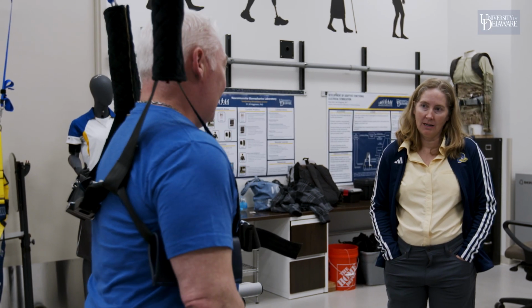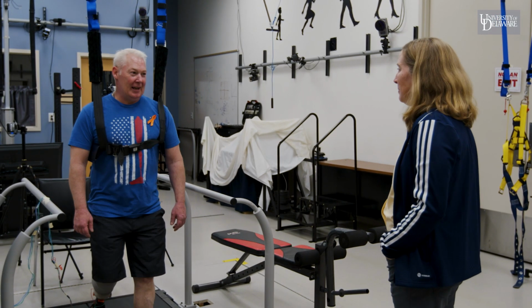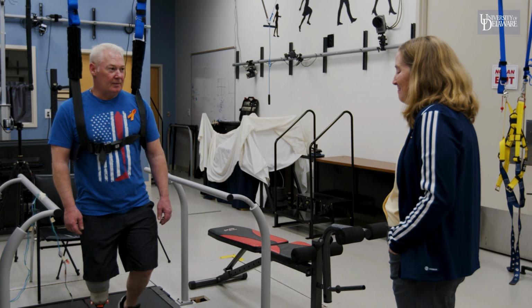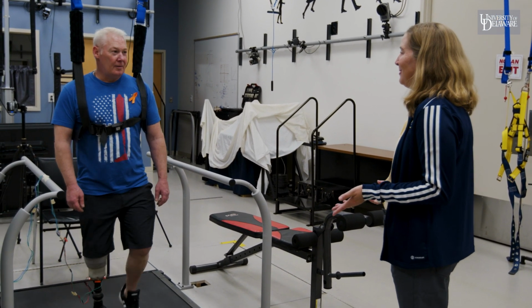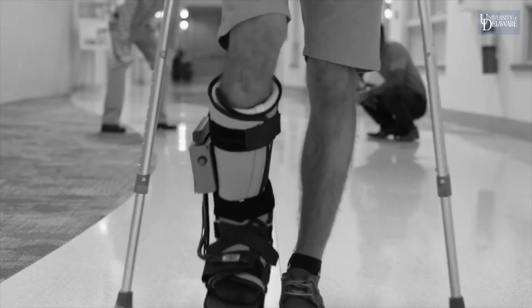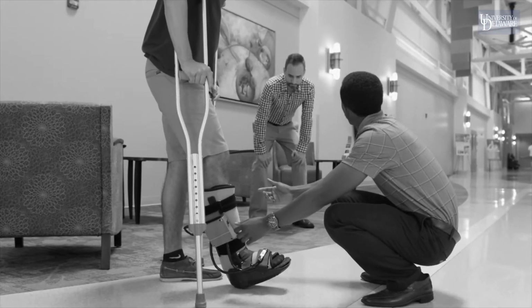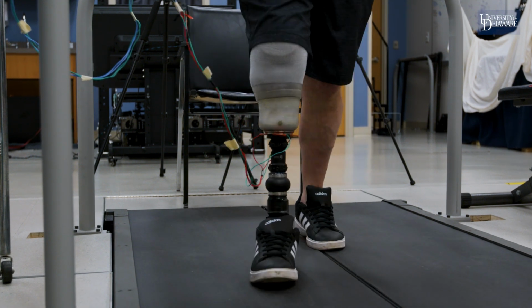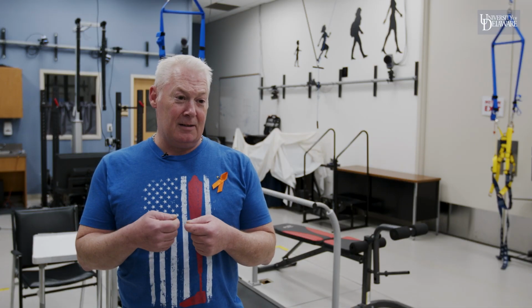We start this process with an unmet need, and it's identifying the need in the community. And honestly, this project has happened really organically. Mr. Horn had approached us a number of years ago when we had a similar kind of force sensing device inserted in an orthopedic boot for individuals who had had an Achilles tendon rupture. And it's pretty interesting now to literally see it being compact and being able to be utilized in a prosthetic.